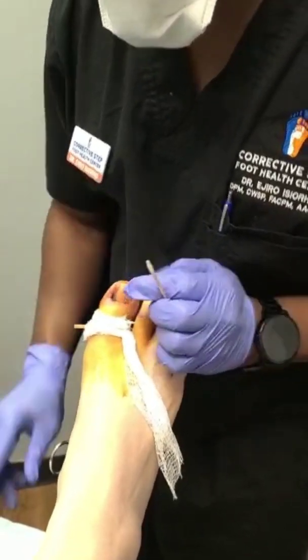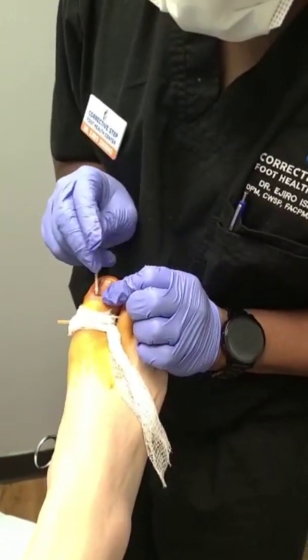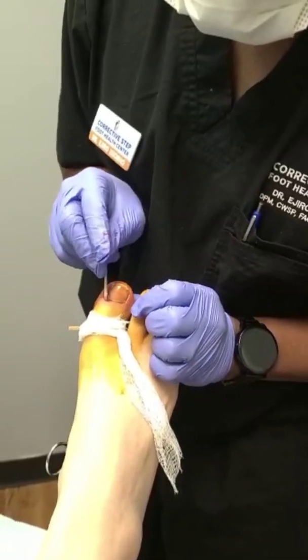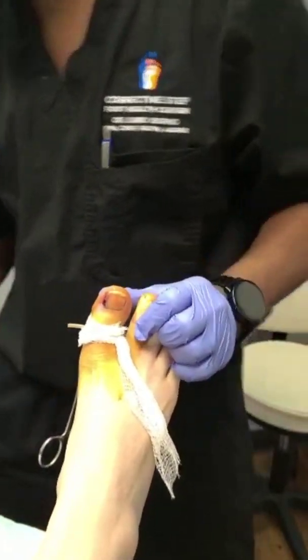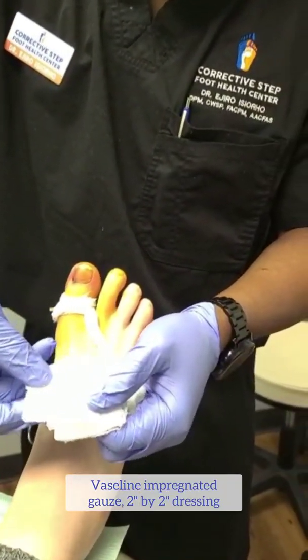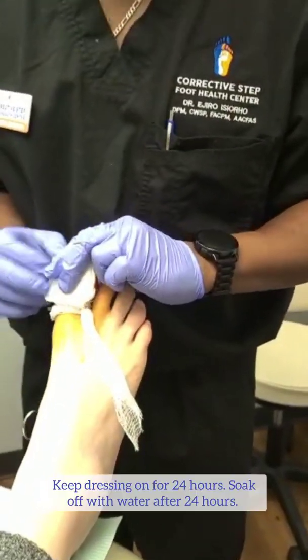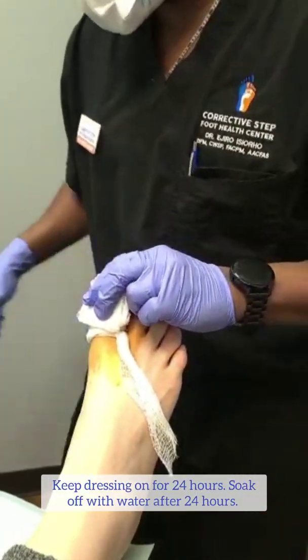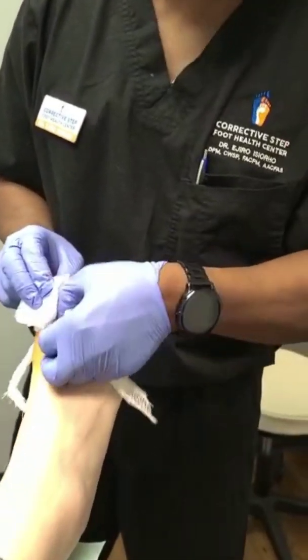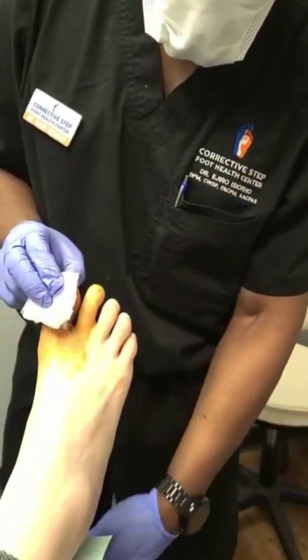Still doing okay? Last one. I'm going to raise you up so you can see what you're left with. Not so bad. So now we use our Vaseline-impregnated gauze and a generous helping of petroleum jelly and 2x2 gauze. You're going to keep this dressing on for 24 hours. After 24 hours, you're going to soak it off. When you soak it off, you want to do it under water — if you do it on a dry surface, it's going to not be fun.